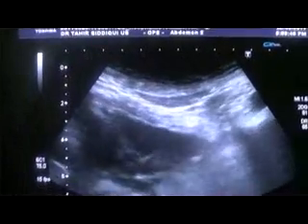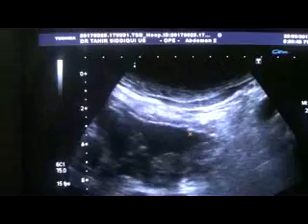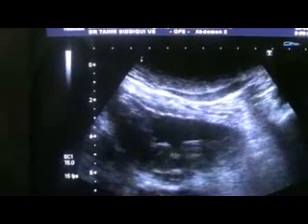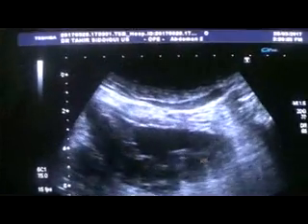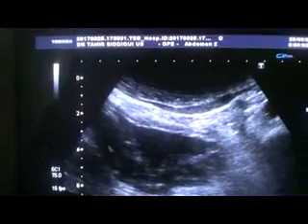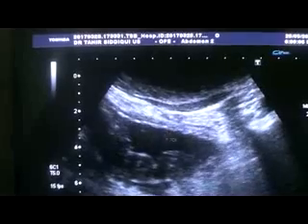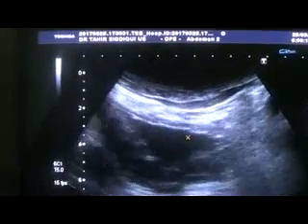Now this layer, in fact, is the main culprit, which is blocking both the UVJs. This is this echogenic layer, all of the posterior wall as well as part of the lateral wall of the partially filled urinary bladder. This is the lumen of the urinary bladder. Anterior wall is intact and of normal caliber.